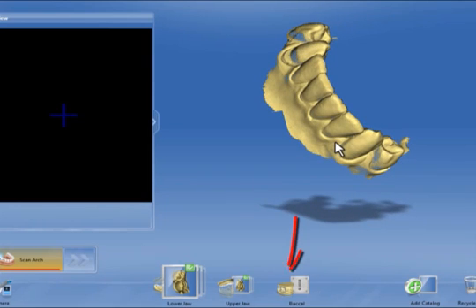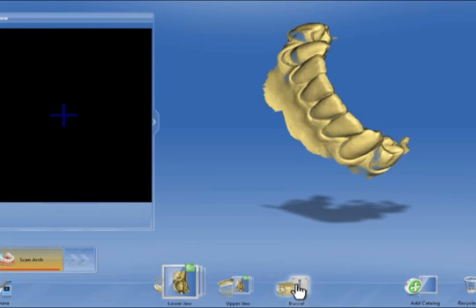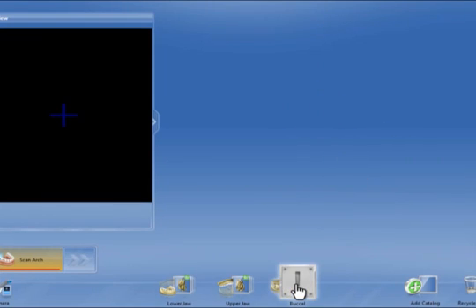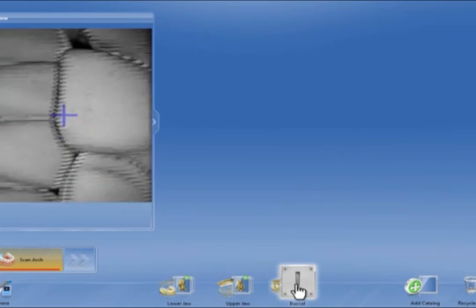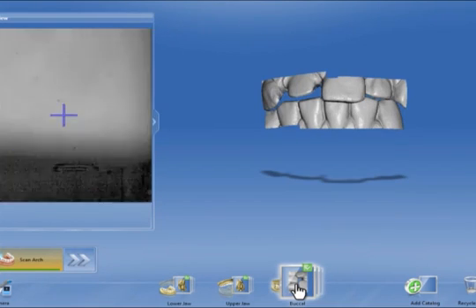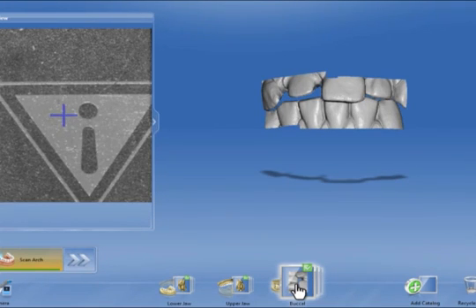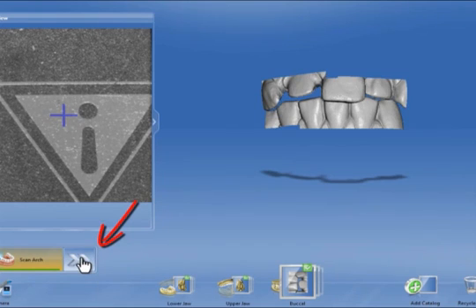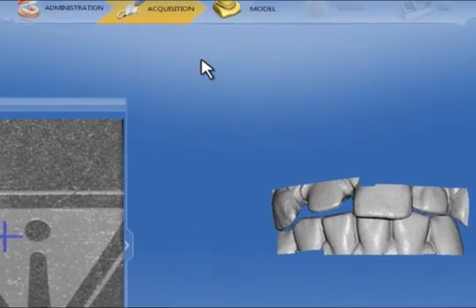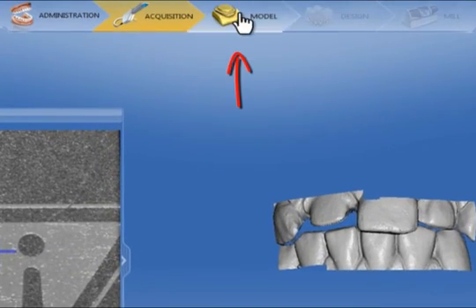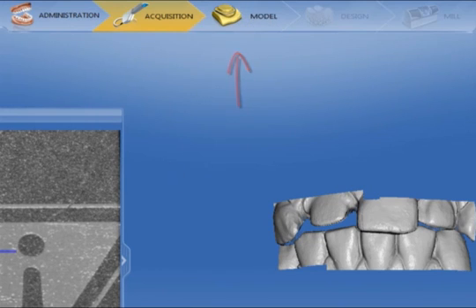Next, we select the buccal catalogue and take the buccal bite registration with two or three exposures. It is recommended to scan slightly from caudal. We are now ready to proceed and can either go to the double arrows in the step menu below or directly over the phase bar above to the model calculation.